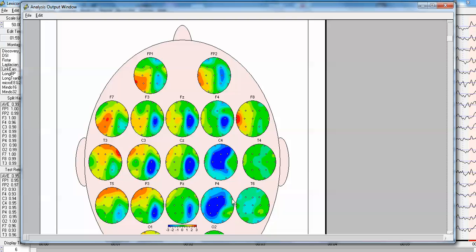The parietal lobe has low connectivity to the right frontal, FZ, F3, C3, CZ, P3, PZ, etc.